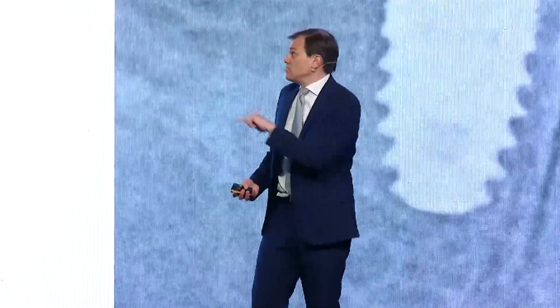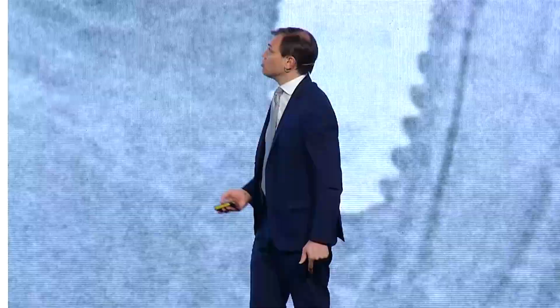It really proves the principle of bone remineralization, that the bone can come back if you have sufficient height of the tissues and if the implant has a design which is good for zero bone loss concepts. In this case, as I said, we had sufficient connection stability, no polished surface, and platform switching that allowed the bone to really come back.